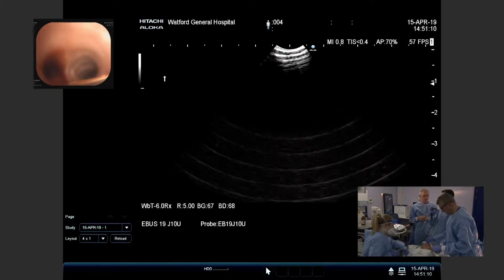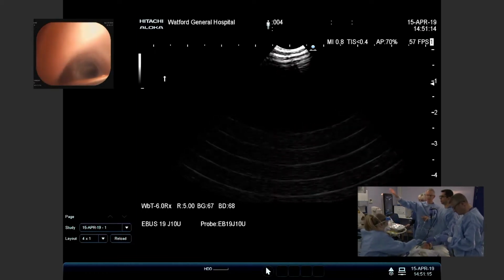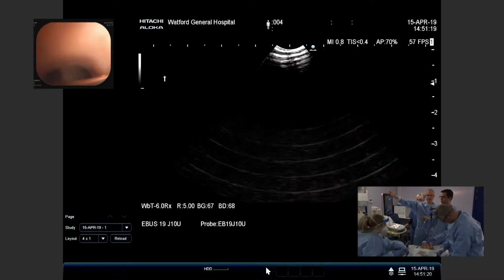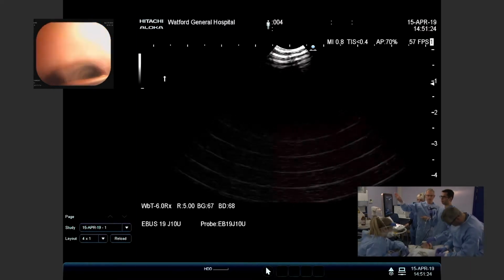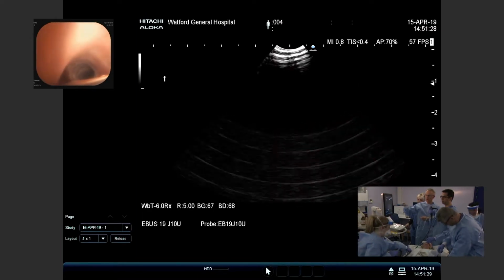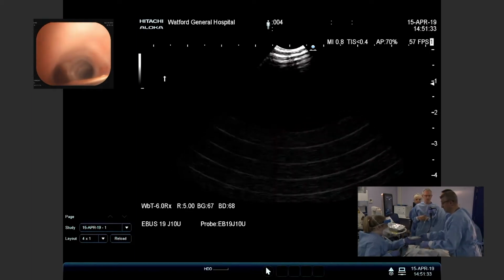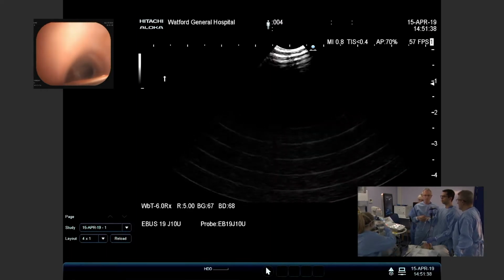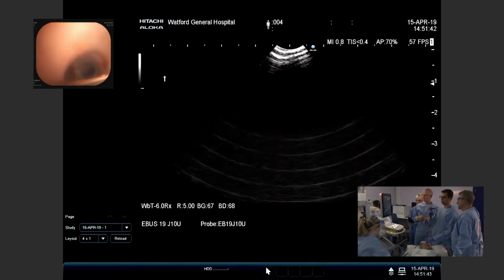Once we've done that, just in summary, you've actually done a complete mediastinal staging. You started on the right-hand side, down at 11R, then station 7, 11R, 10R, then 4R, 4, 2R, and then 4L, rotated to 10L. Did we see 2L? No, I think there was nothing. I thought there was a brief, very small 2L node. Yeah.